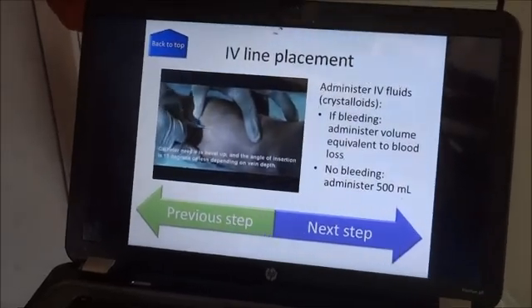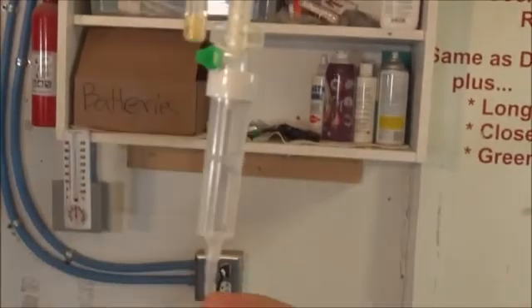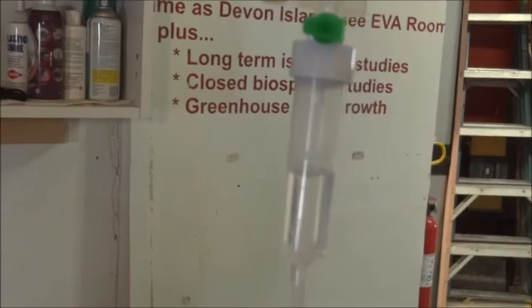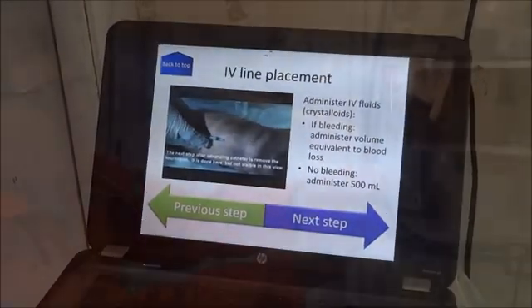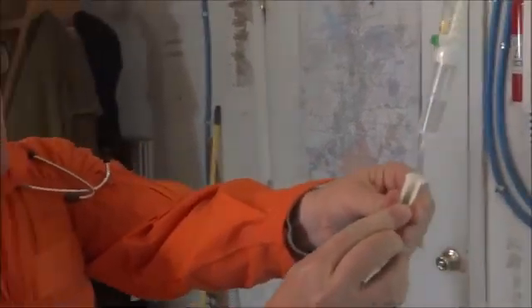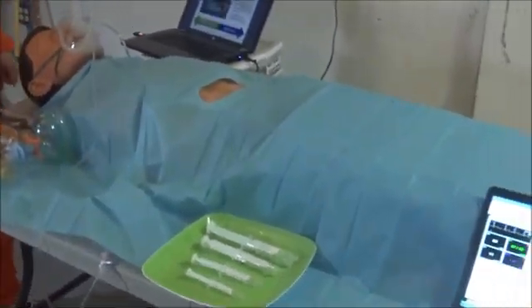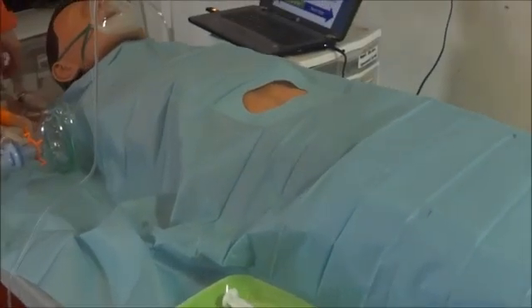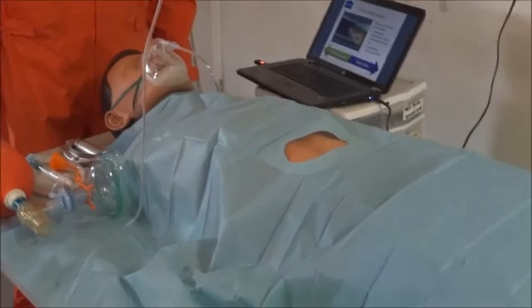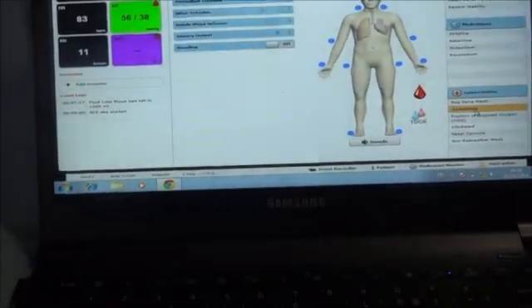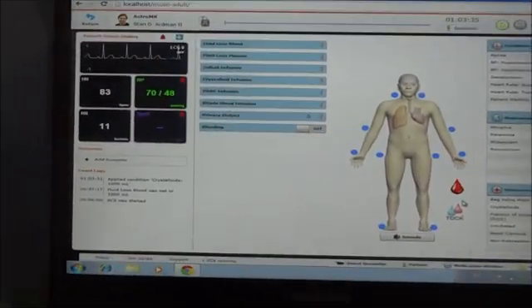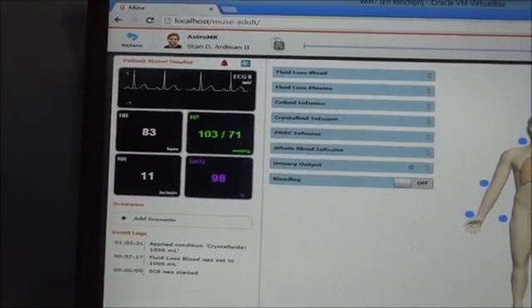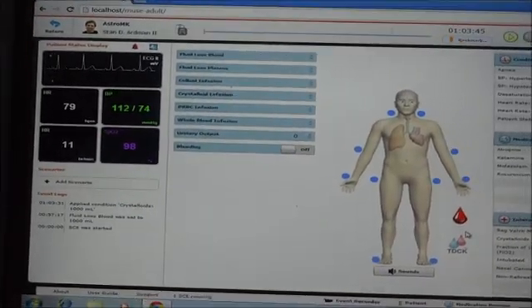Going through the next step, it's the IV line placement. In our case, it's already been done, and we're just starting the IV fluid administration. Joseph is going to have to decide what volume to administer to the injured patient. Because the patient has lost approximately a liter, Joseph starts giving him IV fluids in the same volume. I'm going to input this volume of IV fluid to one liter, and we'll see in real time the hemodynamic response. Thanks to the IV fluid, blood pressure is restored to a normal value.